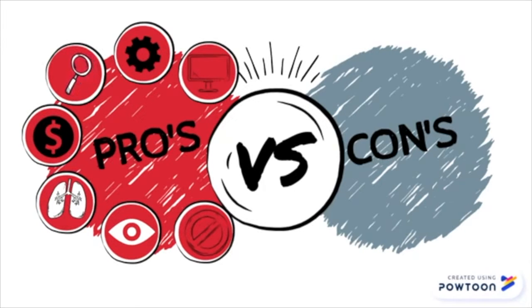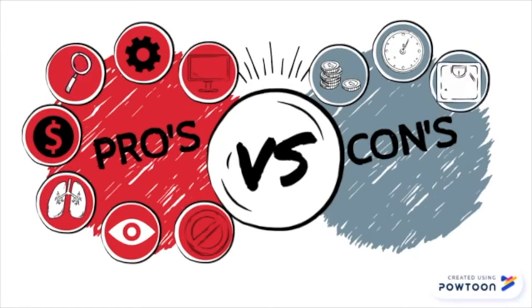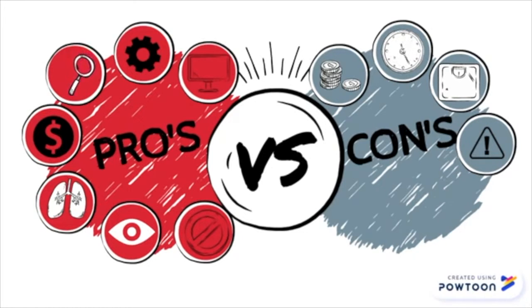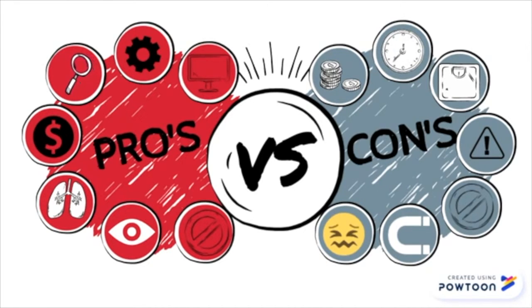However, CMR compared to the other techniques has a relatively high cost. Comparatively, CMR has long study times. Many obese patients cannot fit into many scanners used for cardiac imaging. Patients undertaking CCTA have a slight chance of cancer due to excessive exposure to radiation. CMR requires patients to remain still and hold their breath since respiratory artifacts can degrade images. Contraindications within CMR currently include pacemakers, defibrillators and many other devices. Claustrophobia prevents some subjects from completing the imaging process.